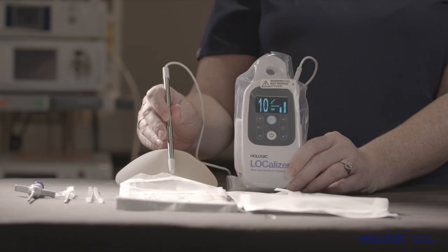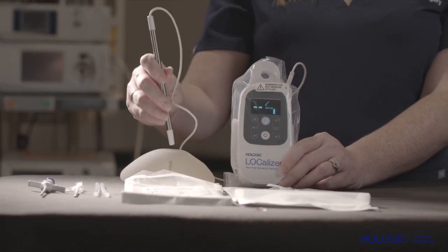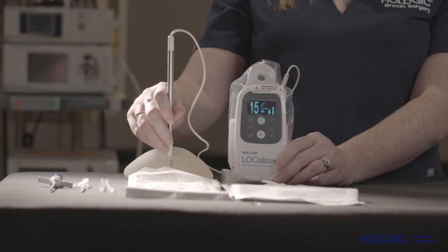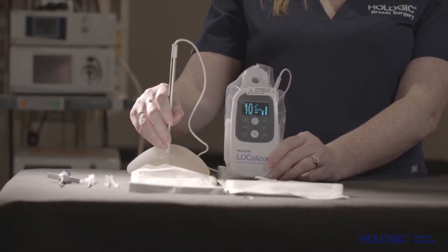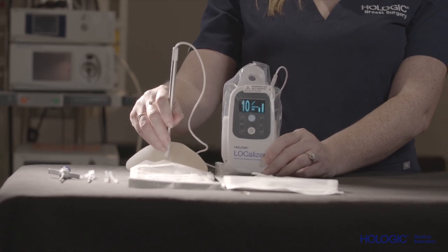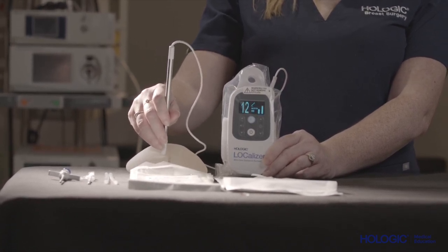Additionally, the surgical pencil probe does not contain a collimator. As such, it reads from the entire way around the probe and is multi-directional. The most effective technique for utilizing the pencil probe is to interrogate the tissue using a cross-like motion — up, down, left, and right — so that we are able to consistently find the lowest distance to the tag. This interrogation technique should be utilized as the surgeon continues to dissect down into the target area.